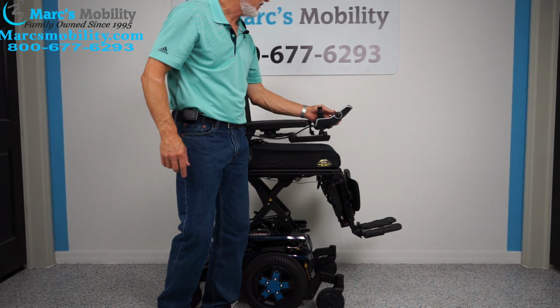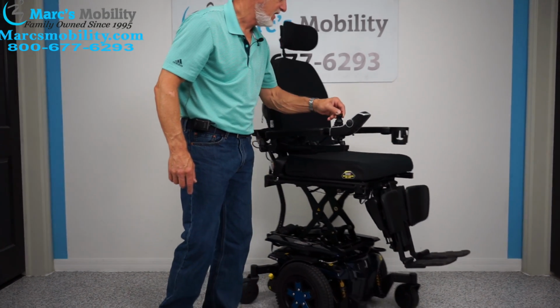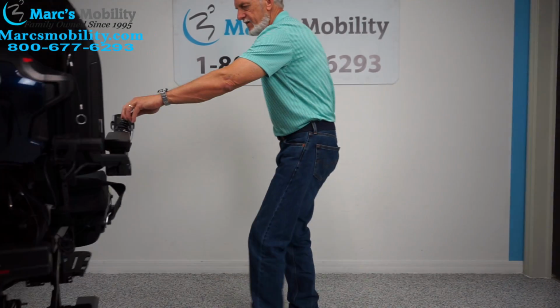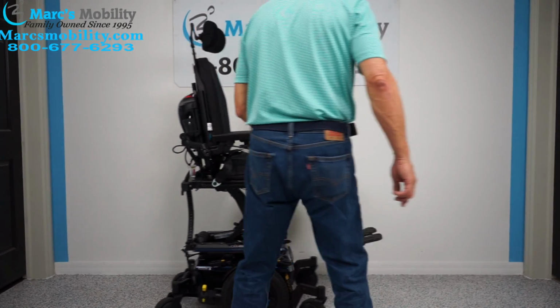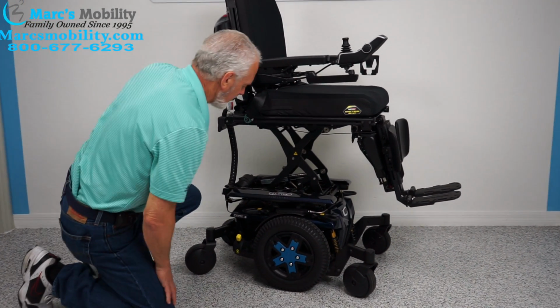Now I can't show you 3-4 miles an hour in here, but I can show you outside. But you can see how it moves, okay? So I'll give you an idea. So while we have the seat elevated, let's look at the base on this chair.